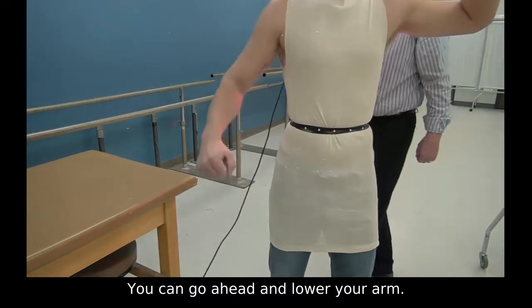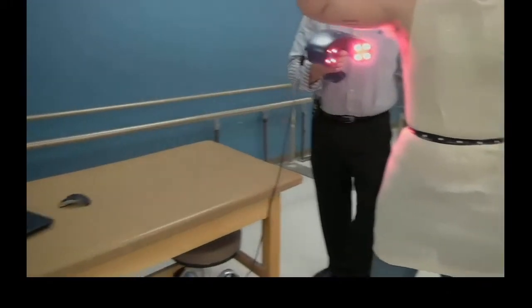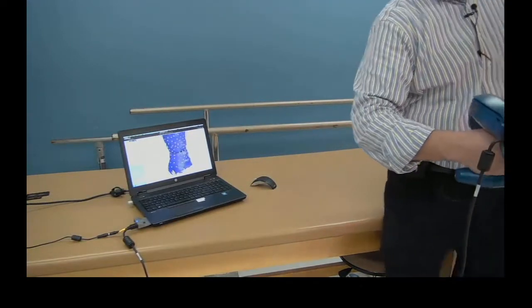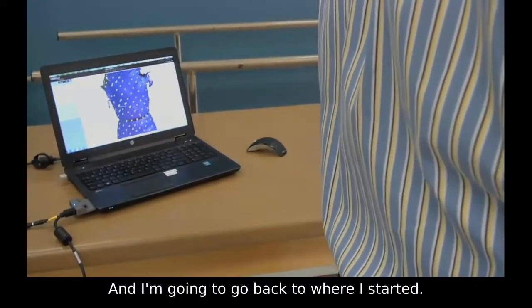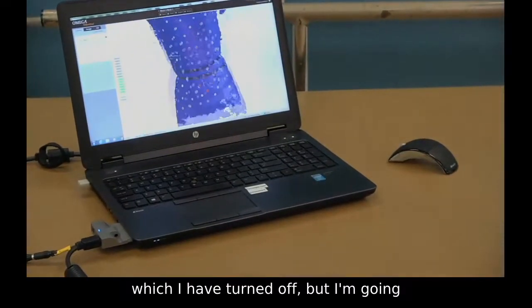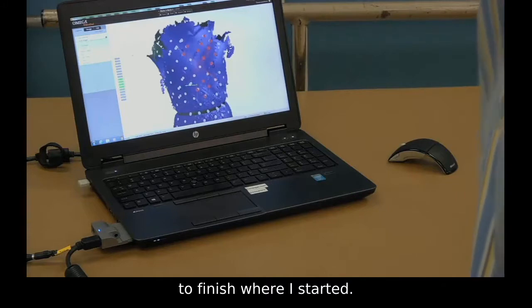You can go ahead and lower your arm. Thank you. You can lower your arm. And I'm going to go back to where I started. Again, this comes with an audible sound, which I have turned off. But I'm going to finish where I started.